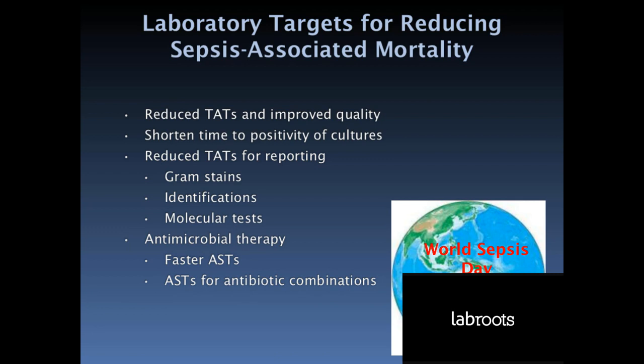A lot of people die of sepsis. I think we can reduce mortality. The rate's going down about 1% every year all over the place. I think that's because of improved blood culture methods. Getting an earlier guide to what drugs to treat with, that shortens the time that the patient is vulnerable.